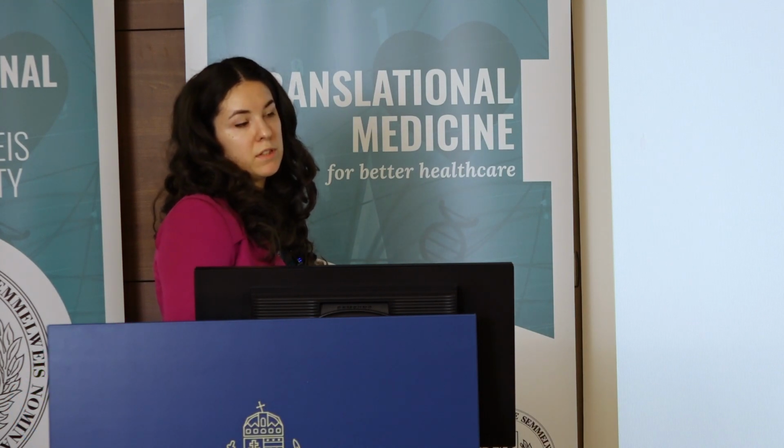My question is regarding your second topic, that the intraoral scanners have some updated versions regarding the software. Can you differentiate these softwares in the shade selections? We haven't investigated, or the articles are not investigating the software versions for shade selection, but of course it is a limitation that software versions can affect, for example, the shade selection and also the accuracy of IOS systems, but these studies are not investigating if there is a better shade selection with the newer software version or not.